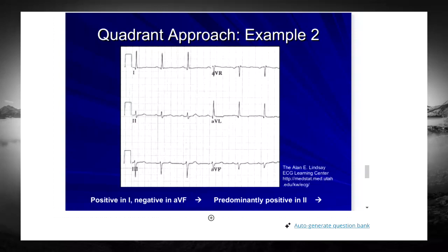Sorry, just a quick question. It's okay. I'm just not getting it. How do we know that lead 1 is positive here? We look at the top and what are we looking at? What you're looking at, again, is the direction of either the P wave, but in this instance, we're looking at the direction of the QRS. So the R wave here, and I'll break it down for you. The QRS is specific parts of this. I should have said this earlier, so I apologize. The Q is this area right here. You see this little divot? That's the Q. This is the R, and then the down slope is your S.